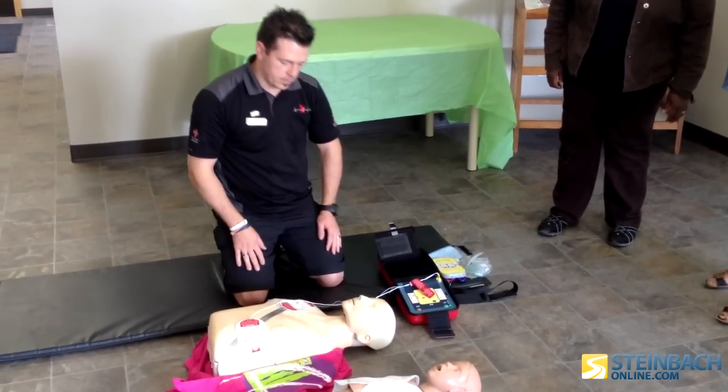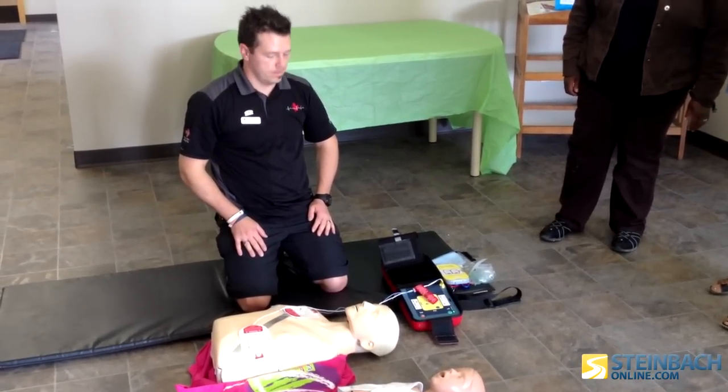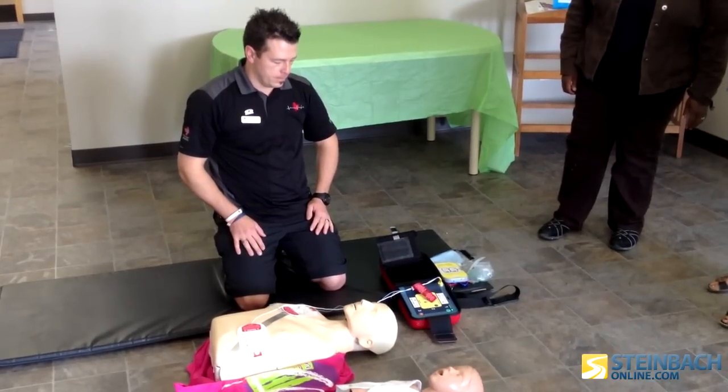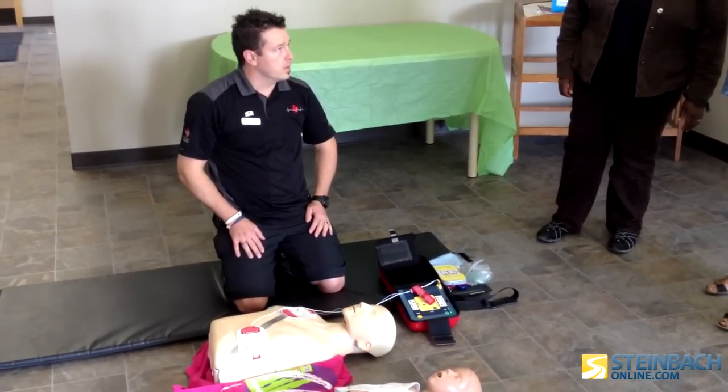Stay clear of patient. Analyzing heart rhythm. Stay clear of patient. Analyzing heart rhythm. Shock advised.